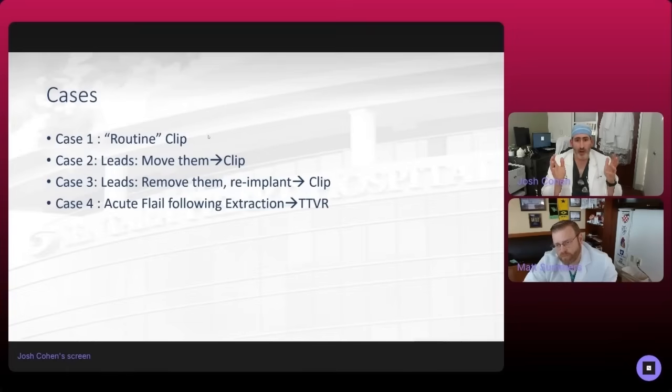Often you guys know as much as I do, right? I'm trying to get you the best picture, but you know as much as I do in terms of the imaging. So when you're on the same page about what we're actually doing, typically you're doing things that I'm ready to tell you about before you're doing them. And I think that's a powerful thing as part of a team, right?